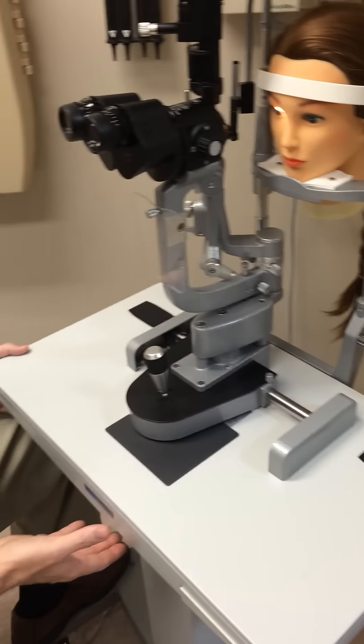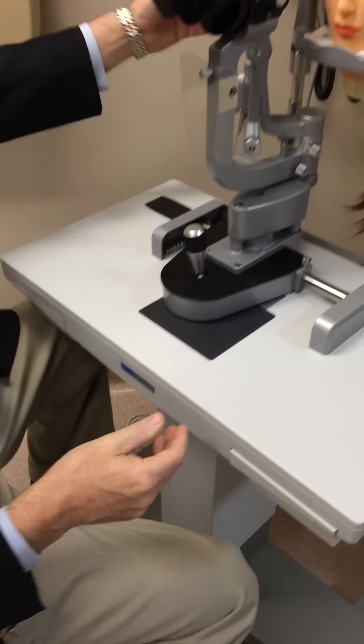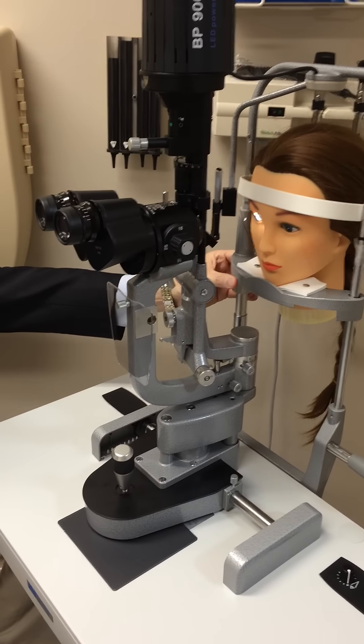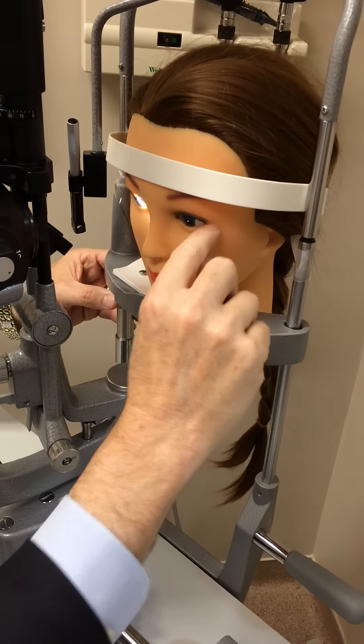When you need to adjust it, you need to reach up underneath. This moves the table up and down — it's spring-loaded, so it moves very easily. Over here, you can move the patient up and down in the unit so that you can get their eyeball where it needs to be, remembering that this line right here lines up with their lateral canthus.